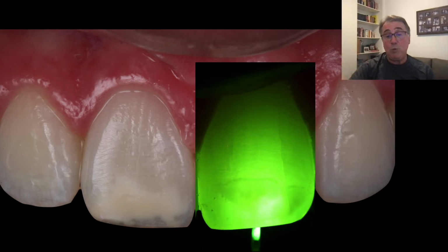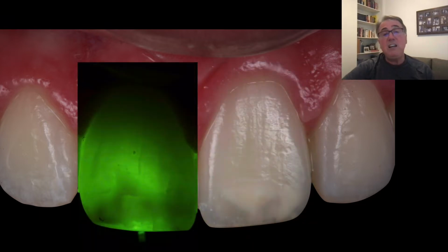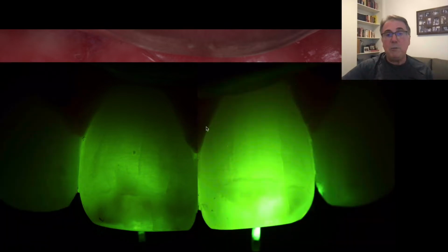And when you do that, if the lesion kind of disappears, you can imagine that this is a shallow lesion. On the other hand, if the stain, if the dark spot keeps showing through the transillumination, it's because it's a deeper lesion. Okay, so you can compare here both of them, a shallow one and a deep one.